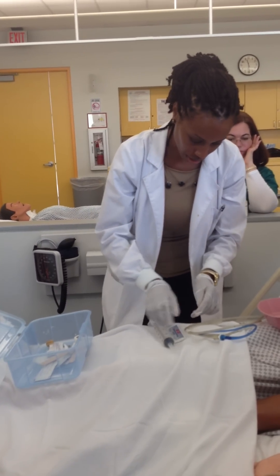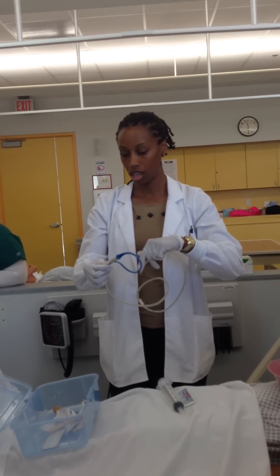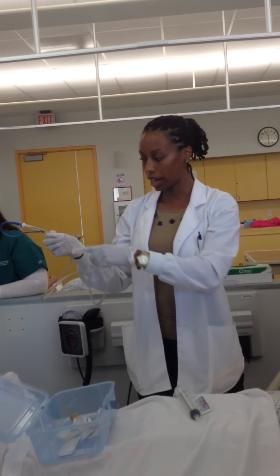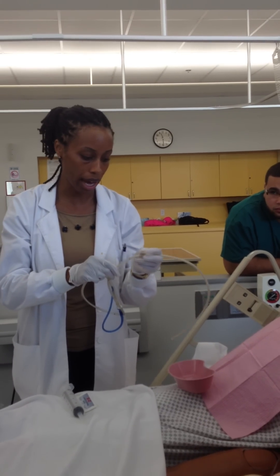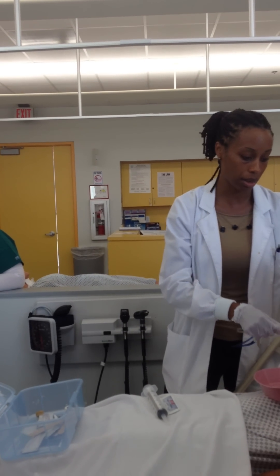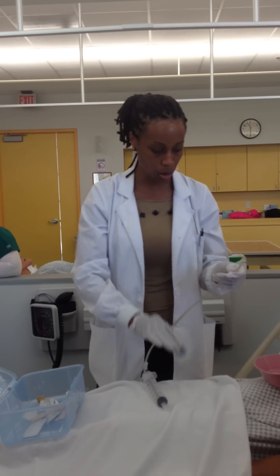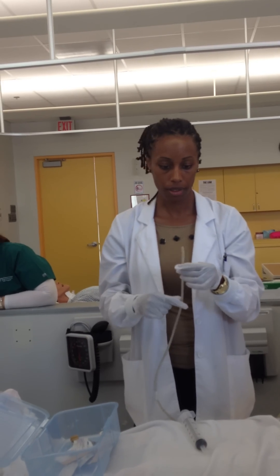Before you actually start, go ahead and connect it, because if their stomach is full of gastric content or fluid, it's going to start to backflow once you get to the stomach. So in order to not have a spill, go ahead and clamp it — that way when it gets there it'll stop. Also, if you start to move down and you see fluid coming back before you reach your tape, still continue going until you've reached your mark, because you've made a baseline measurement. Then you're going to lube about the first three to four perforations — that's just to pass through the nose.